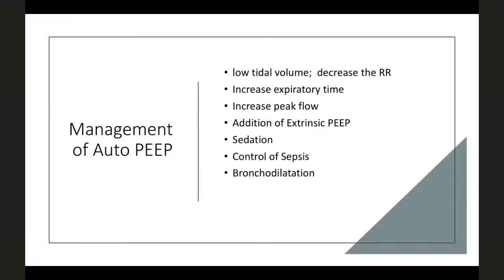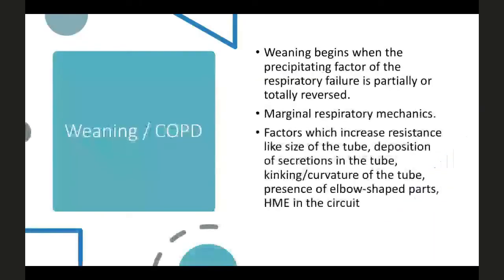So management of auto-PEEP: low tidal volume, reduce the respiratory rate, increase the expiratory time, increase the peak flow, add extrinsic PEEP, good enough sedation, control of sepsis, bronchodilation. Everything will help tackle the primary condition and minimize auto-PEEP.